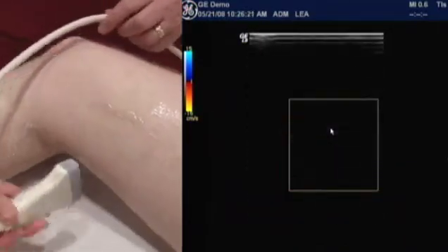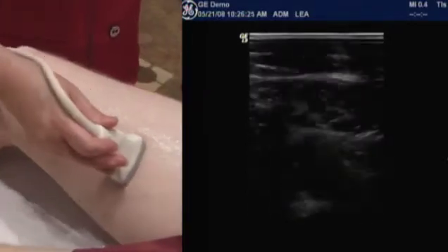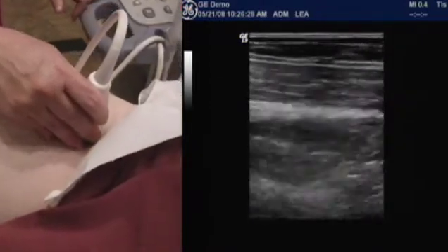At about this point, that artery and vein are going to pass through the muscle and come up behind the knee. So we've really scanned the superficial femoral artery for the extent that we'd want to, and you'd want to come back and record some velocities.